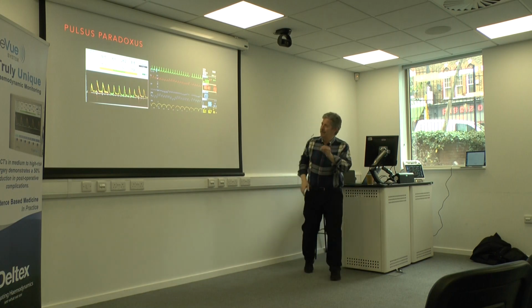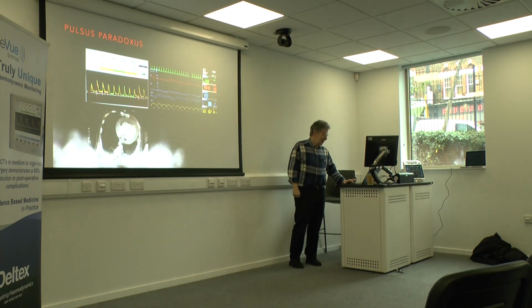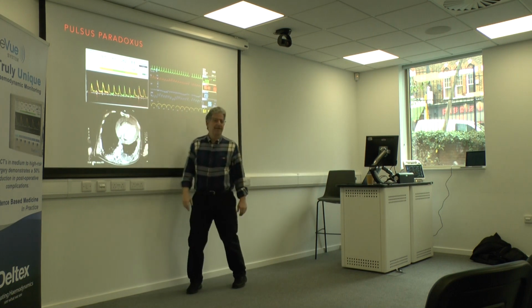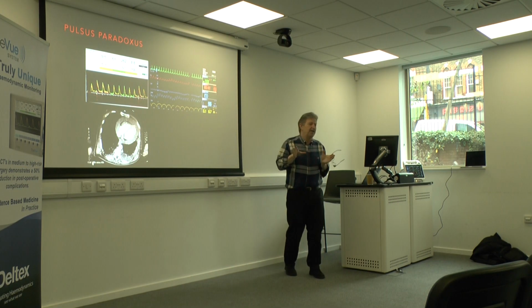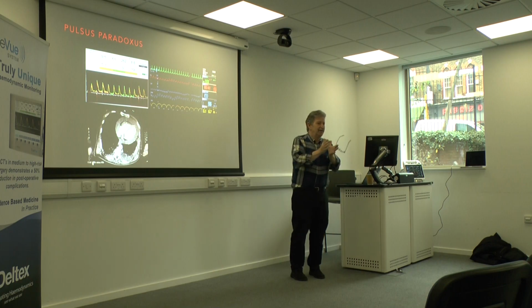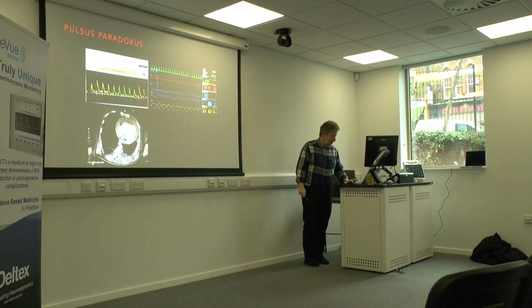And you can see the tachycardia, 156 heart rate, I suppose. And you can see a nice rim of fluid around in the pericardium, obstructing the flow. So again, it looks very constricted, in inverted commas, hypovolemic. It's hypovolemic to the left ventricle. It's just that the fluid can't get into it, so it's pumping hard, but it hasn't got much volume to pump. And obviously, relieving the pericardial fluid made a difference.